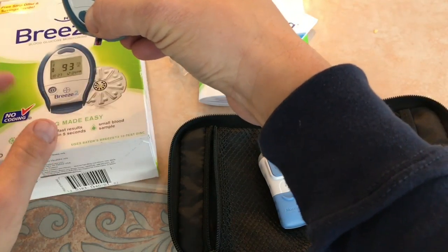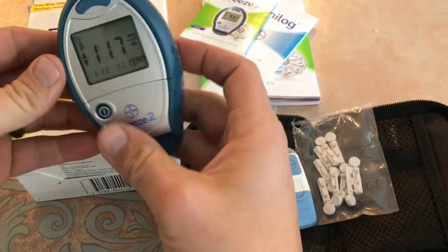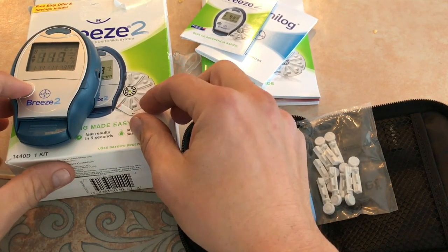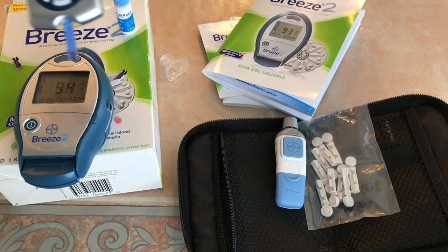There's the quick release at the top — you just push the button and once you push it correctly, the strip falls out. So I started reading the manual trying to figure out what's wrong with this thing. I also grabbed my other precision tester to make sure and figure out what was going on.